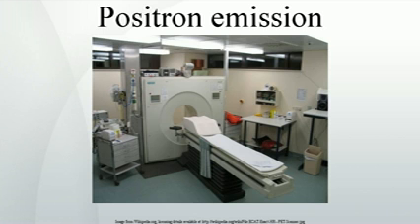The development of a number of novel probes for non-invasive, in vivo PET imaging of neuroaggregate in human brain has brought amyloid imaging to the doorstep of clinical use. The earliest amyloid imaging probes included FDDNP, developed at the University of California, Los Angeles, and N-methyl-11C-2-(4'-methylaminophenyl)-6-hydroxybenzothiazole, termed Pittsburgh Compound B, developed at the University of Pittsburgh.